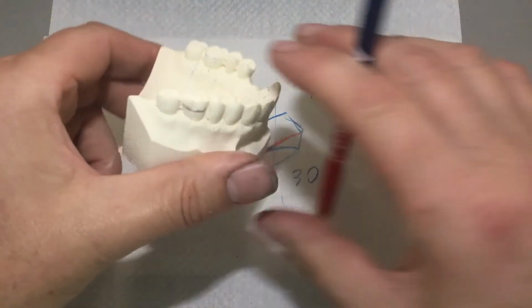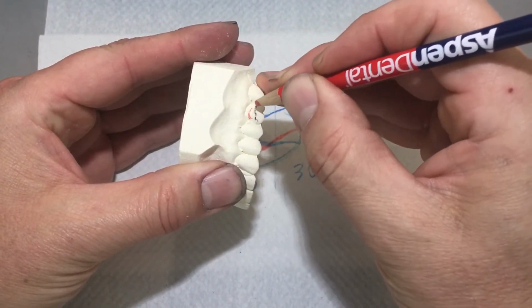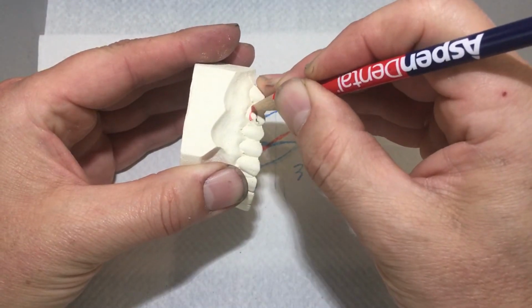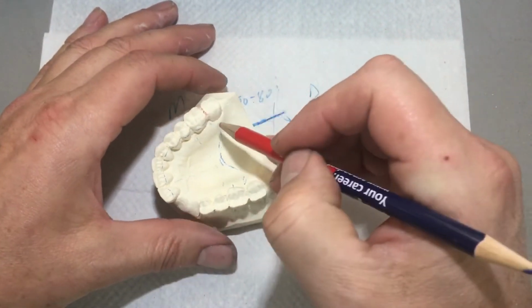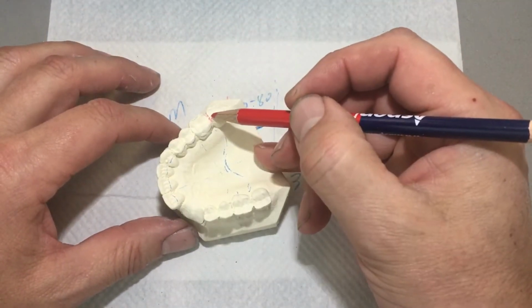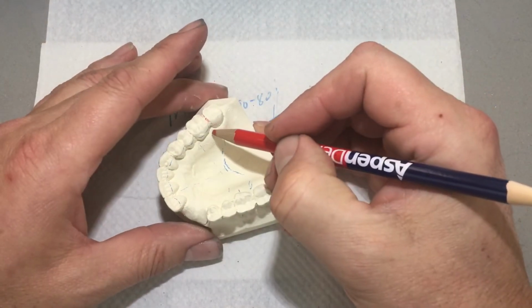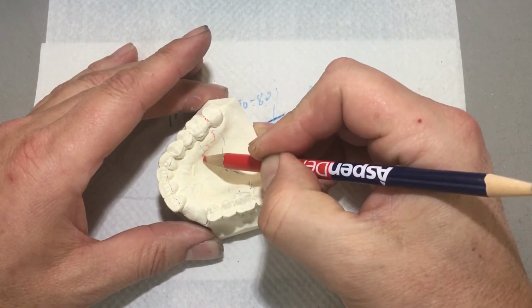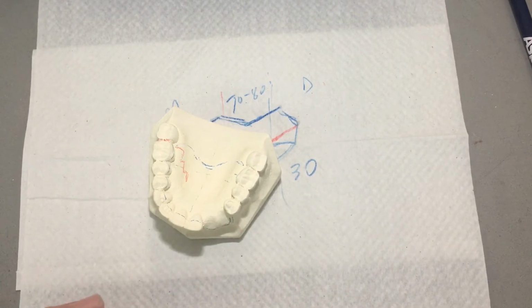So now your job is to, with a sharp pencil, I'll mark the line in red, and bend the wire adhering to the tooth 100%, crossing the occlusion as tight as possible. Now this will also be indicative of the opposing dentition. If the opposing dentition is tight there, then maybe some design change or some alterations have to happen. And then we're going to come into the palate and we're going to go this way here with the retentive tag. So I'm going to attempt to bend one. And this looks similar to the shapes that we started with, does it not?